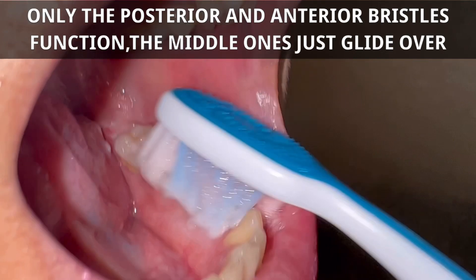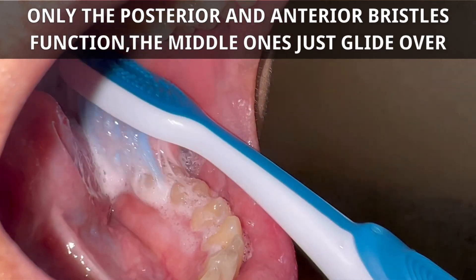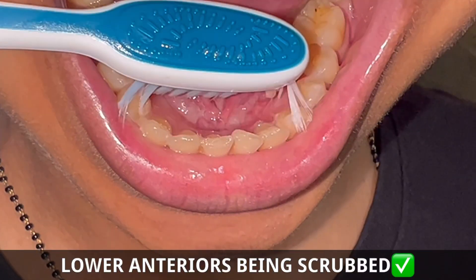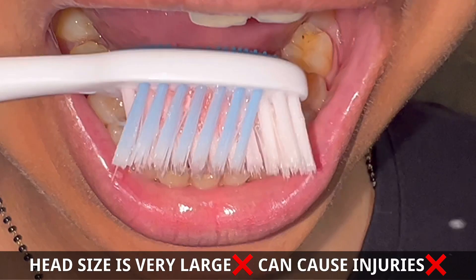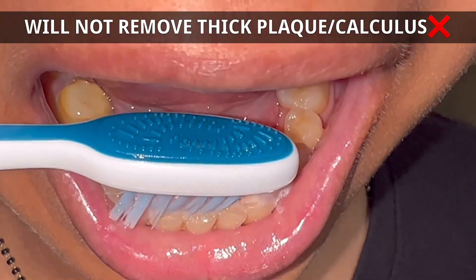One thing to notice here: the middle section of these bristles, they just glide. The posterior and the anterior ones actually function. This is how the lower anteriors are being scrubbed — does the job perfectly. One thing to notice here: the head size is actually very large and might cause problems.